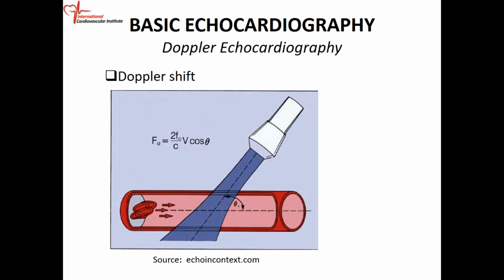If the patient in actuality has an aortic valve area of, say, 0.6 centimeters squared, which is critical, the patient probably should go to surgery if they're symptomatic. And if you don't pay attention to your angle theta and you mess up the calculation and get a valve area of 1.2, you might think that the symptom is related to something else, not the valve area, because 1.2 is not critical. So doing an accurate study is important, because of this angle theta.